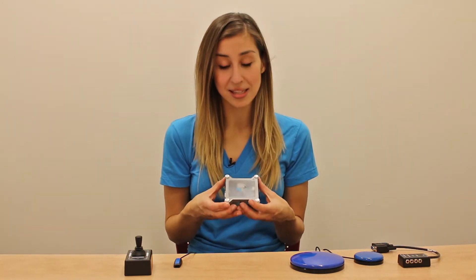The first thing you might notice about the Tecla Shield is its size. It's small, about the size of a deck of cards. It's designed this way so that it's portable for its use. This means you can use it anywhere from your wheelchair, desk, or bed.